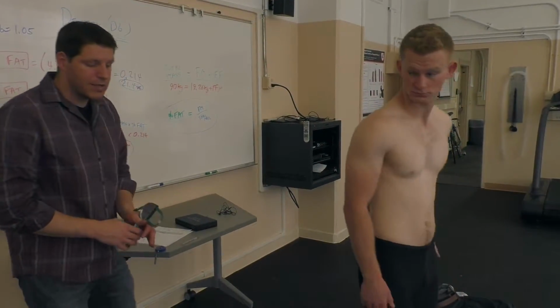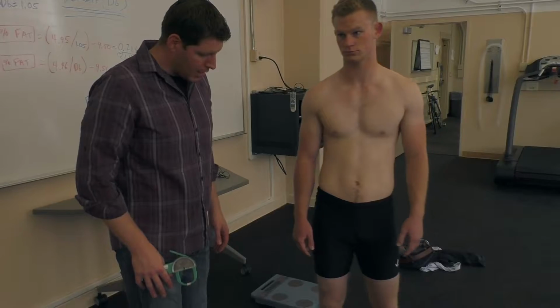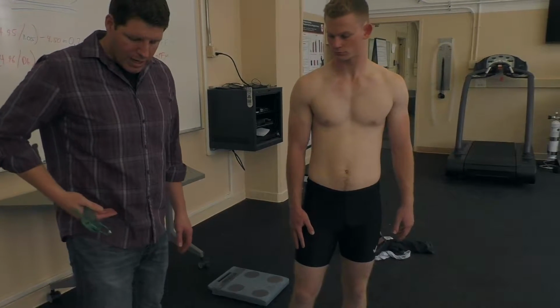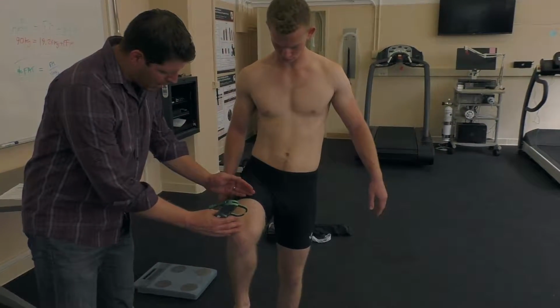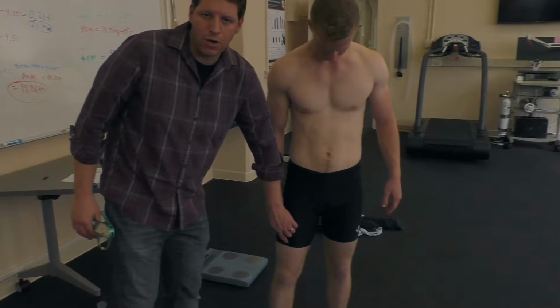The last reading is the thigh. Okay, now the thigh can be difficult to get to. It's typically sort of midway in between the patella and the point at which, when we raise our leg up, where we see some division there. So go ahead and raise your leg up for me, okay? And we're going for about halfway in between. Good. Now go ahead and lower your leg. You kind of mark that with your finger, okay?